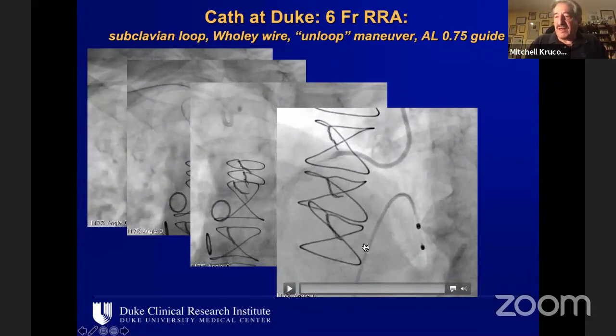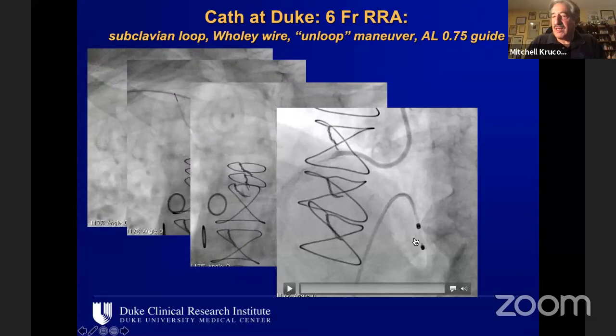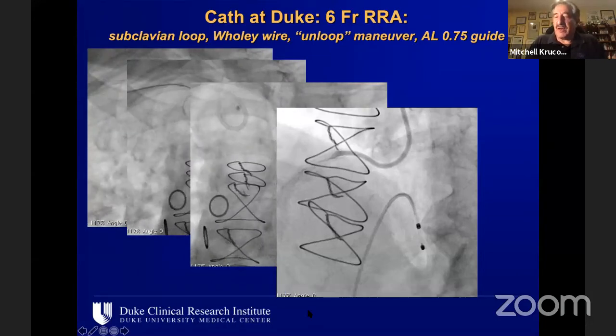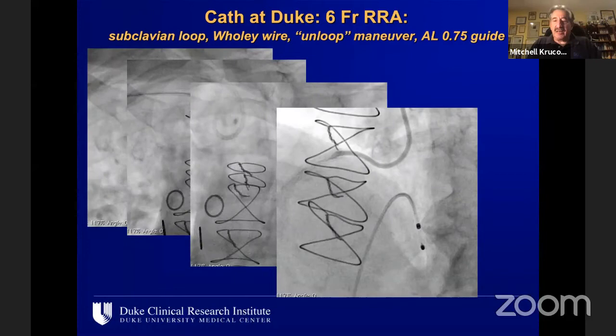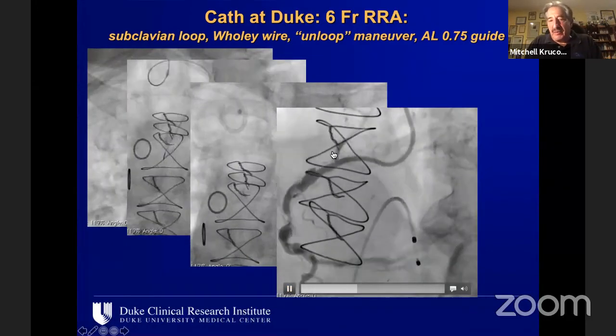This was in our fairly early experience with the orbital atherectomy device. You can see we did put a pacemaker or temporary wire in for this right coronary. I don't think we would do that today. We tend to treat more with aminophylline if and when needed. But you can see from the guide catheter, we've got great support.